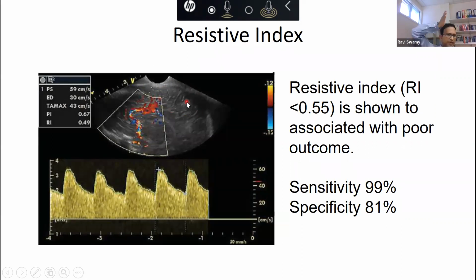So you're cutting the brain exactly in half, so you're looking at the midline. This probably will be the corpus callosum. Yeah, that will be the corpus callosum. And when you get to that one, you put a color Doppler, and you will start seeing the blood flowing through the MCA, or sometimes the ACA. At the middle cerebral artery, you will put a pulse wave. When you put color, you can look at the flow through that.